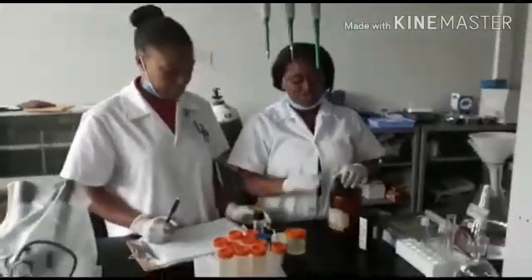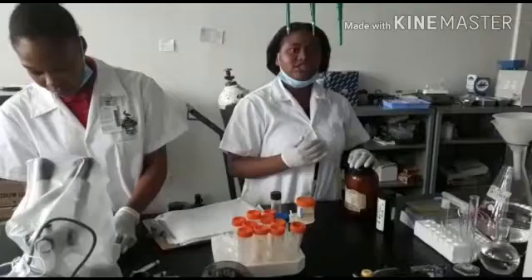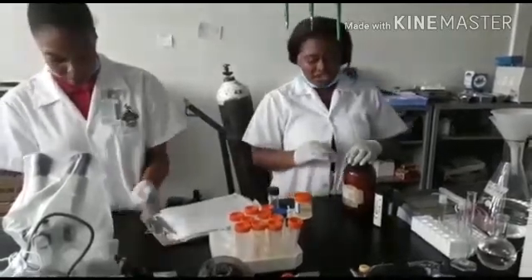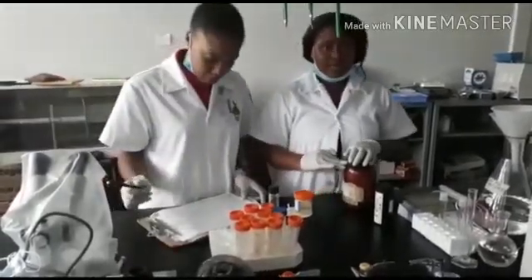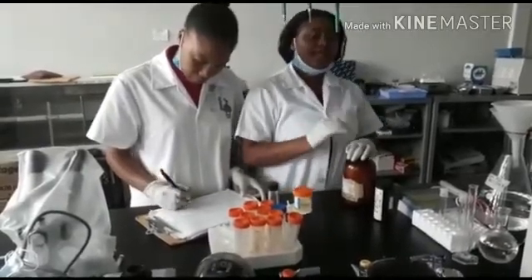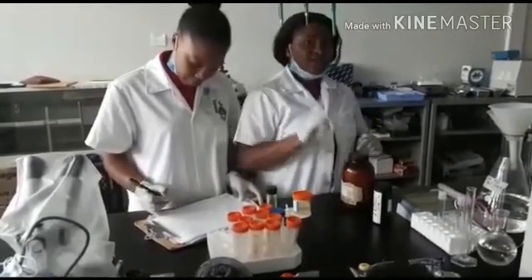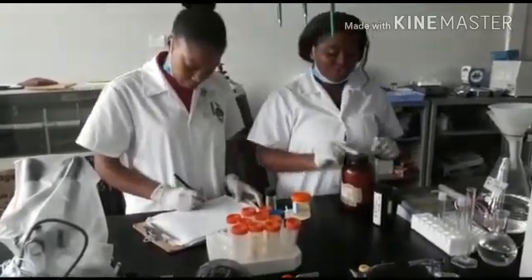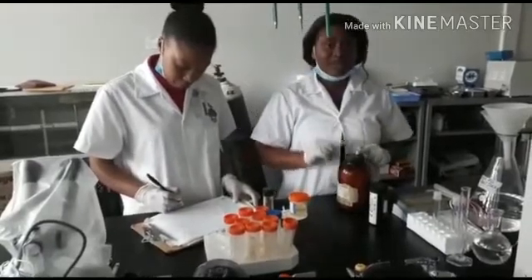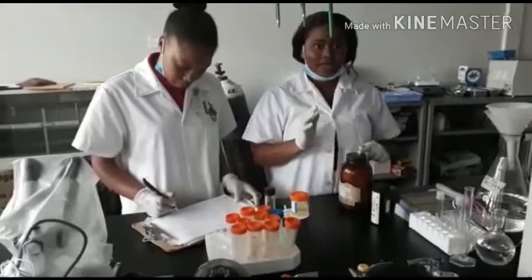Now the first urine is not collected, the reason being it is usually highly concentrated, so it's flushed. We usually collect the urine after that, and each urine that is poured into the specimen bottle is recorded. At the end of the 24-hour period, I need to mention a very important fact: the urine has to be refrigerated, because if left open, it allows for the growth of microorganisms.